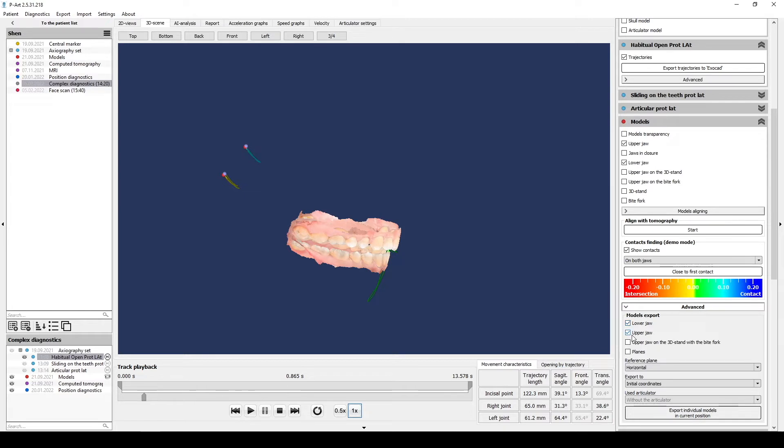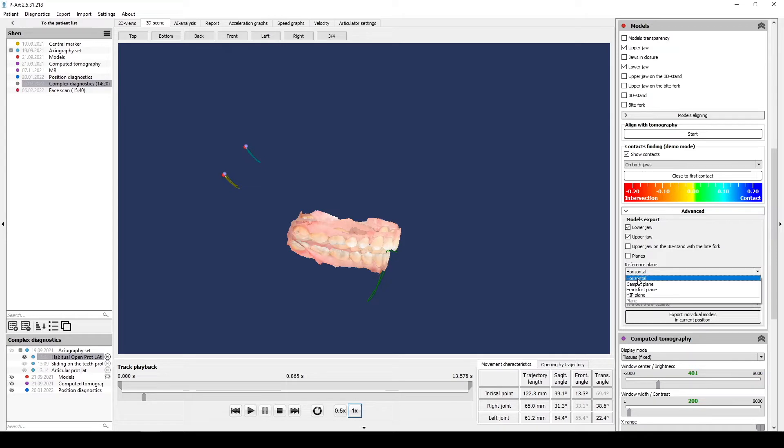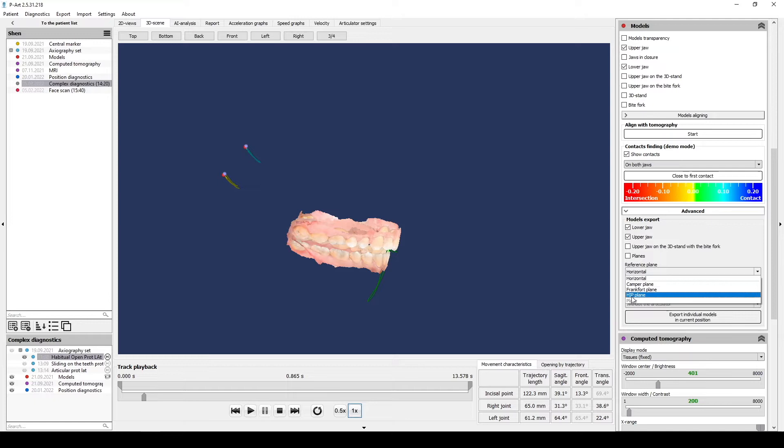Next step is to select reference plane which you need: Horizontal, Camper Plane, Frankfurt Plane, or Hip Plane. It will be possible after you mark them on the advanced cephalometry on CBCT.